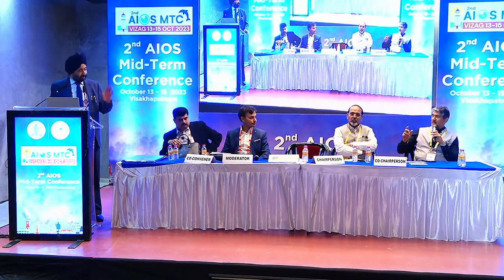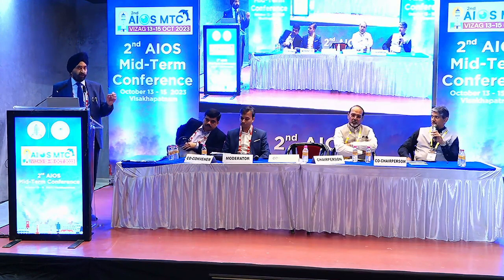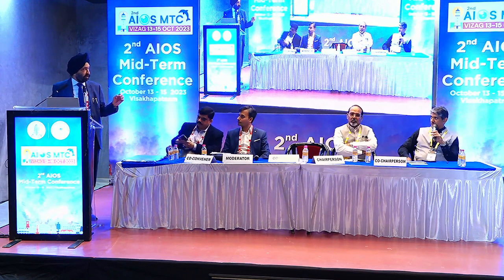Yeah, that's what I'm saying. Only the spot spacing and the line spacing. I agree, spot spacing and line separation can be varied. That we have been doing, to optimize the energy, but the spot size is fixed for a machine. So what I'm saying, the spot size I think for Zeiss is 4 microns. No, the spot size basically depends, because it's like the plasma which expands. No, that's the expansion, but the spot that actually hits.